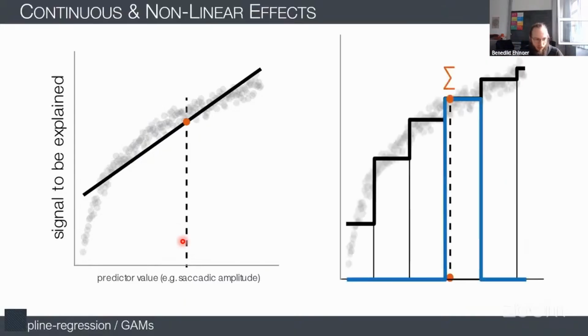And by doing something like this, here we have predictors. We could sum up, and while there's now only one predictor available, and the other ones are all 0 everywhere, of course. So the sum, bear with me why we are summing here. But we're always summing. We have these matrix products, etc. But we can sum up and we can predict the signal, and suddenly we are closer, in some sense, to this underlying nonlinearity, right? So we moved from fitting one parameter here to fitting 1, 2, 3, 4, 5, 6 parameters here by categorizing basically a continuous predictor.